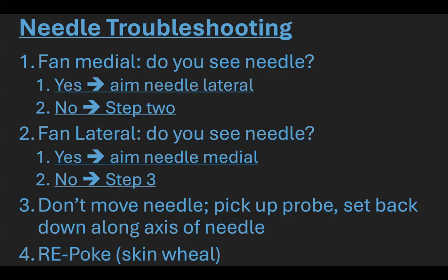Something else that I do with this, Bob, is I commonly put my probe down. I don't like skin wheels because skin wheels are localized areas. I do a skin line. Where the needle is, I do a full line, because I know they're going to move it a lot. If they come in again, they're still not going to shove through, because the pain is really from the C fibers in the skin, in my opinion, just from blocking each other. That has been a useful tool when I see people, especially with interscalene blocks, and I know they're going to tilt and get all over the place. That has helped me in the past for residents.